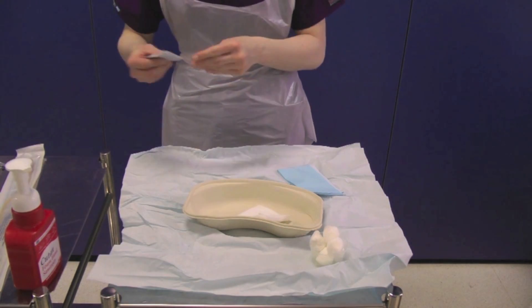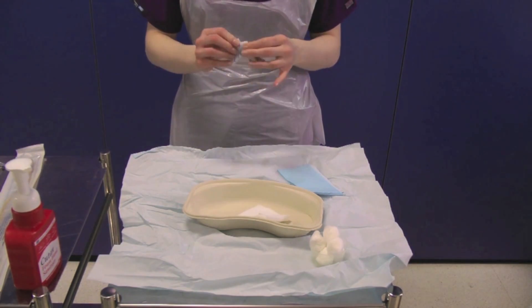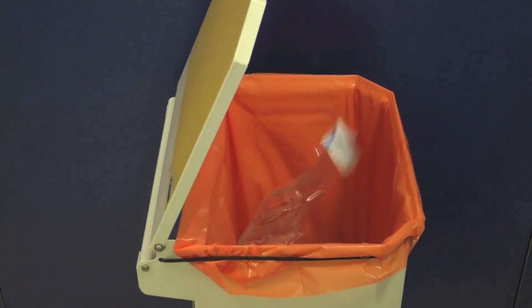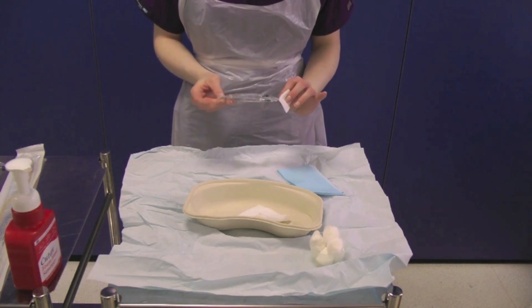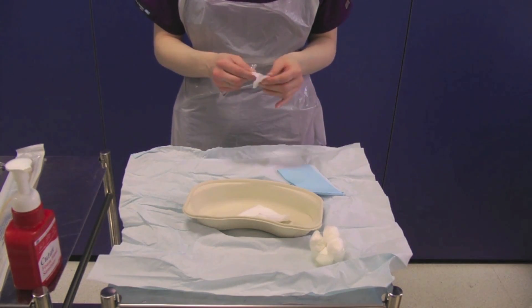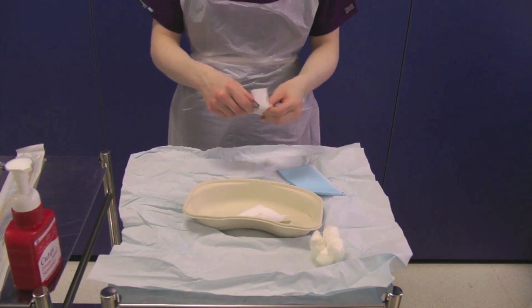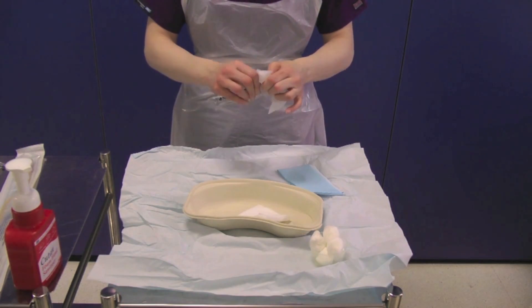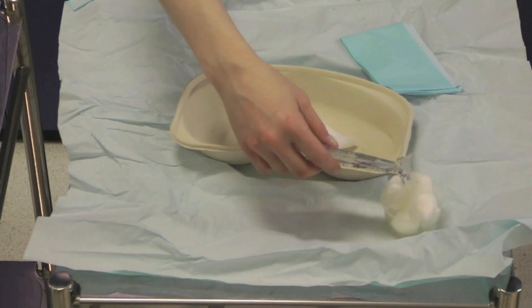Take your first chlorhexane wipe and check that it is in date. Also check the expiry date of the saline sachet. Clean the top of the normal saline packet and open, pouring the saline into the pot. Repeat this process for the second saline packet.